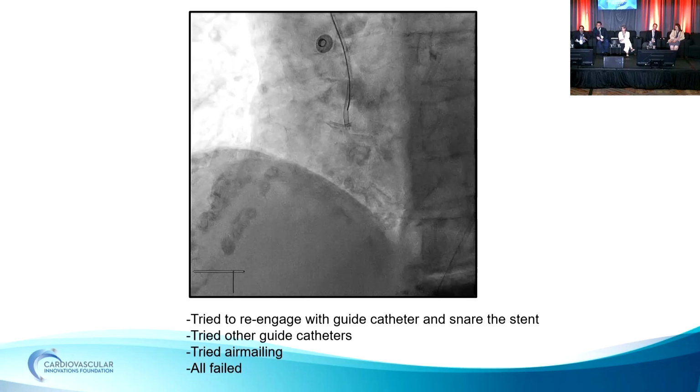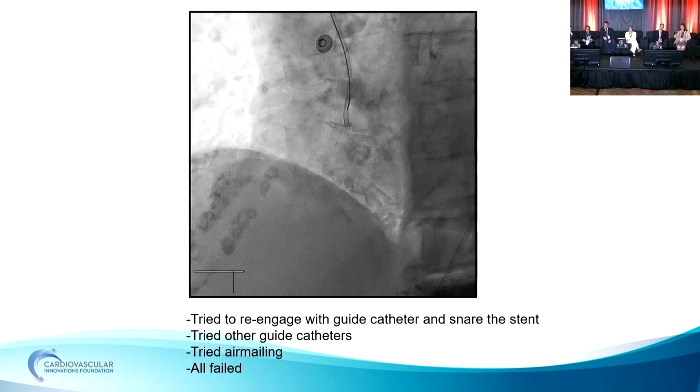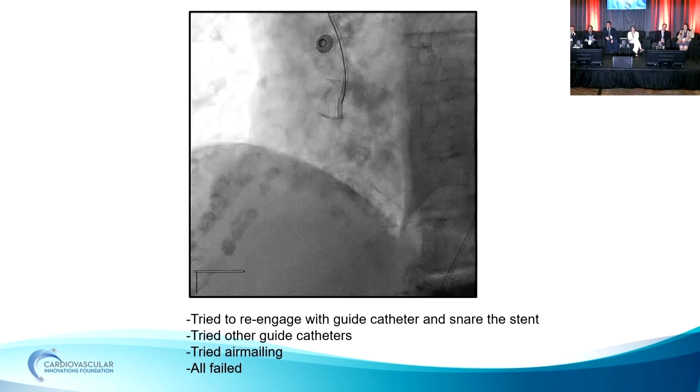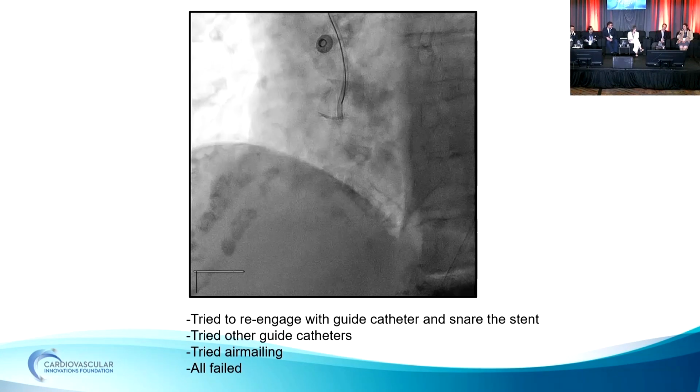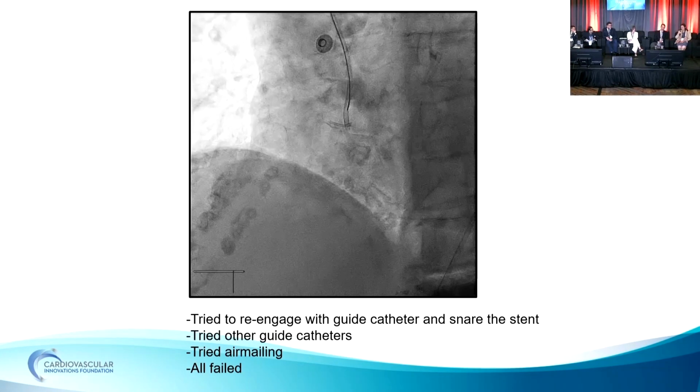3D RC, yes. Yeah, 7 French 3D right. Sometimes it's really not helpful. It's a guide, whether it sits immediately, otherwise it just doesn't work. You can't really manipulate it much. Yeah, so I feel like once the guide is not sitting, the whole case is just going to be a slog the whole time.